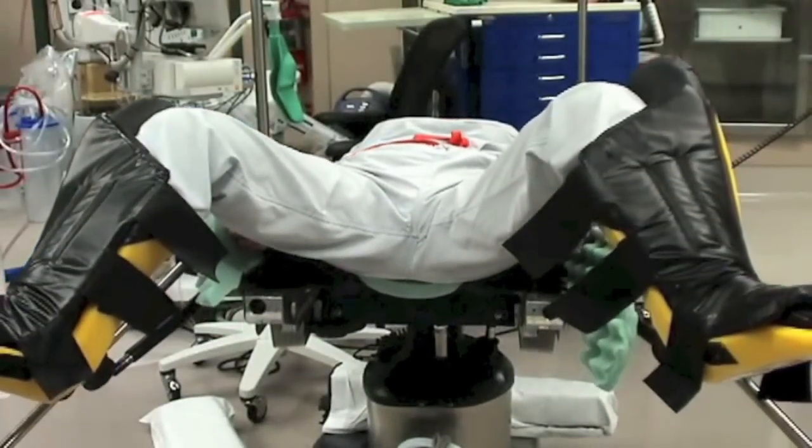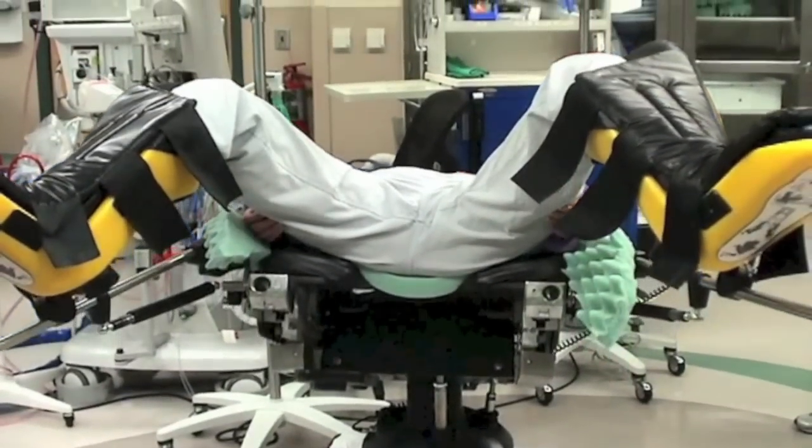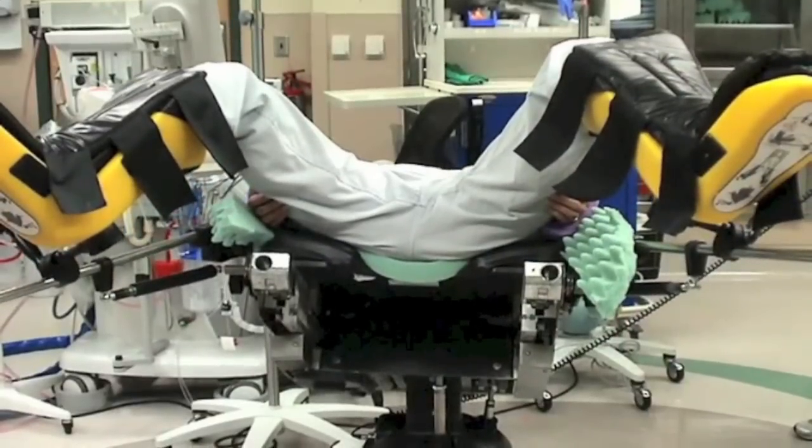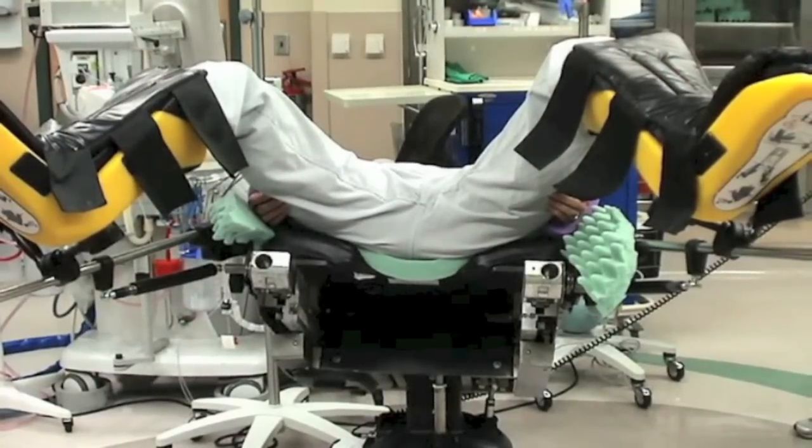Again, when the patient is placed in steep Trendelenburg, it is important that the patient does not slip significantly on the bed so that the buttocks remains on the edge of the bed for better manipulation of instruments within the vagina.